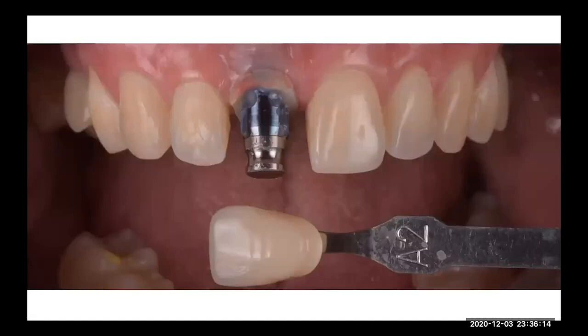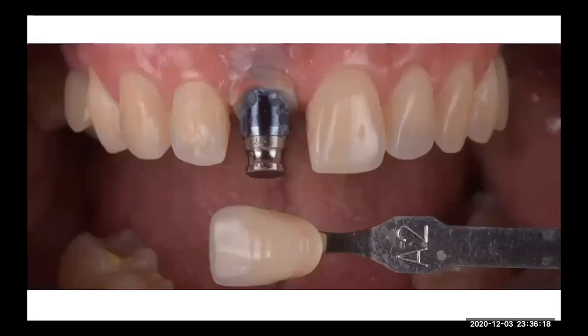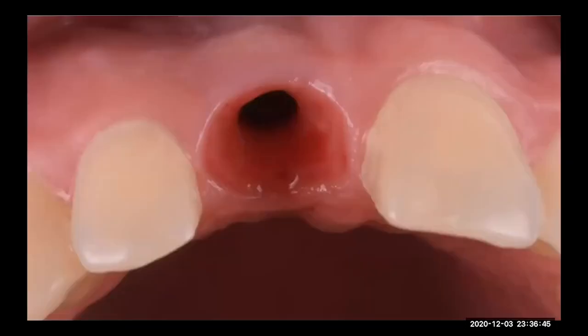So this is a tooth that has a resorption, and the doctor placed the implant, then tried to take the impression and tried to take the color. But for me, that color is wrong because he already manipulated the tooth, he already manipulated the mouth. The tooth at this point is dry. So I tried to explain to the doctor, but anyway, we made the crown and tried to match the color he sent to us.